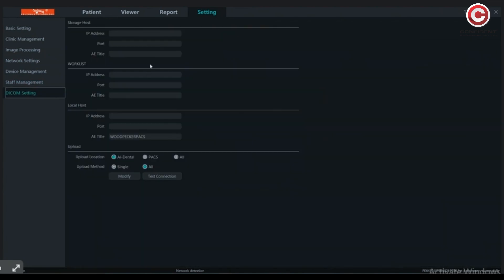You can integrate a DICOM server with this application by entering all the required details.